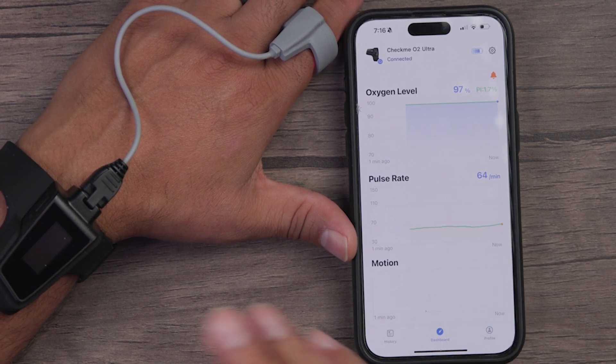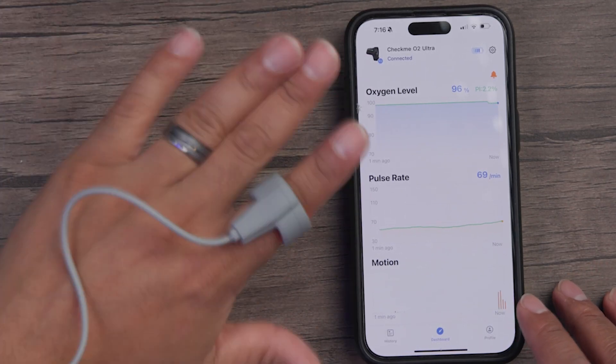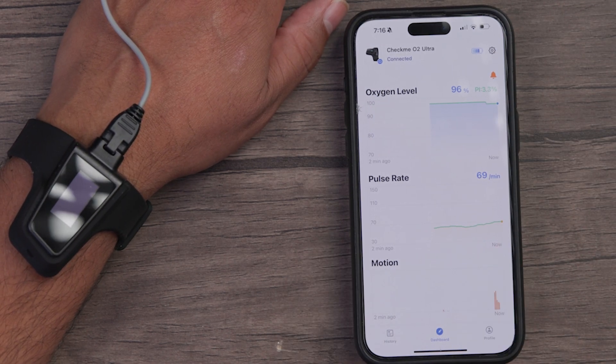At the bottom, we'll see a motion tracker. This device is not meant to be used during sports, but if you were to engage in some kind of movement, it would track that movement. You can see the spikes as it picks up the movement, and it correlates that along with the oxygen level and pulse rate on the overall timeline.